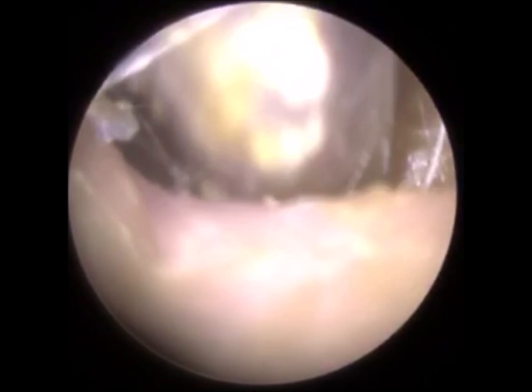So I've just gone in back with the Jobson horn, but you can see there was a lot of fluid at the base, a lot of bleeding there. Client again, complete comfort, not experiencing any pain. Obviously, if he was, we wouldn't have continued. But again, he was cheering me on here.